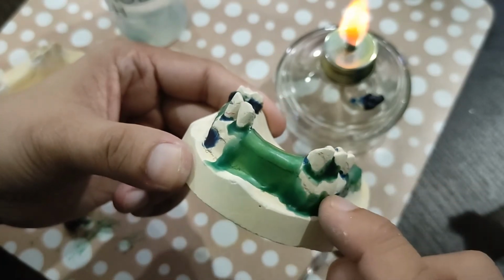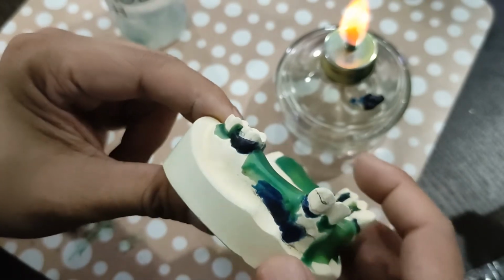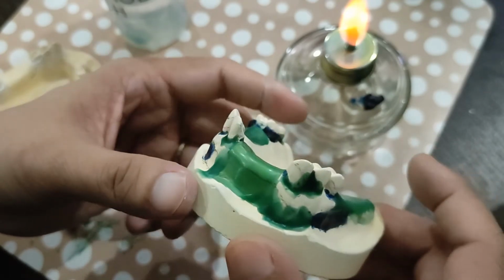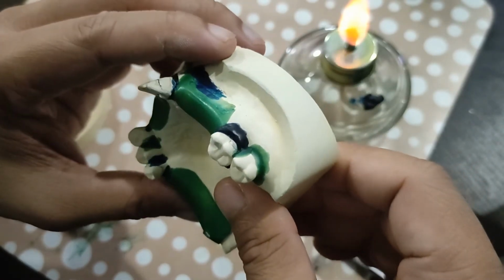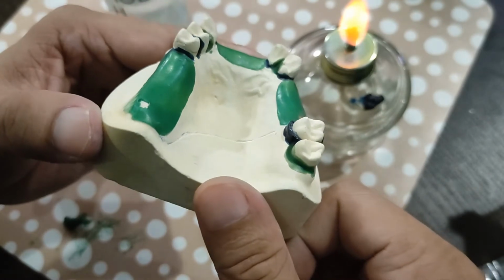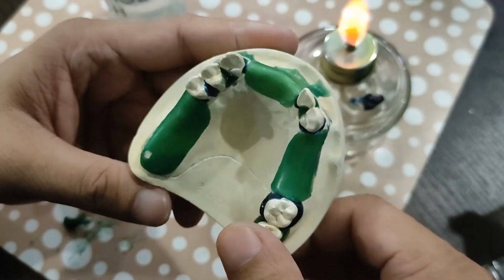So every undercut that I can find that's not going to be included in the design, or any rigid components are not going to cross, you block it out so that I can easily remove it when I take the impression. No? Mas madali siya makuha ng impression, and I can duplicate it easily. Alright, so that's the upper. Next, we will go to the lower.